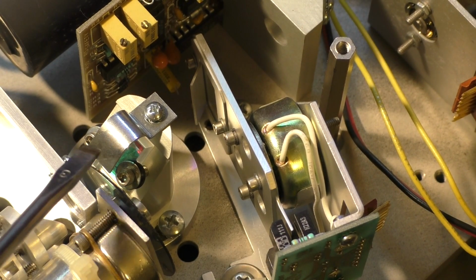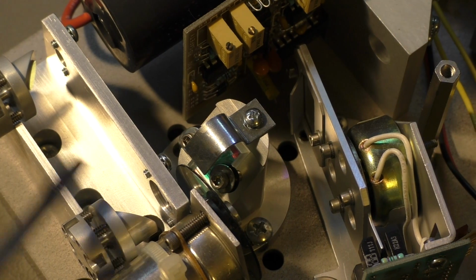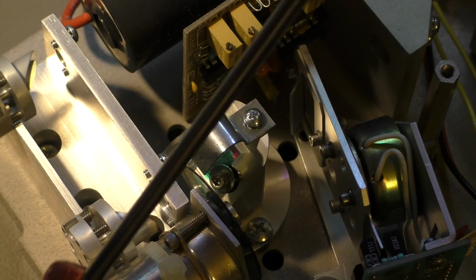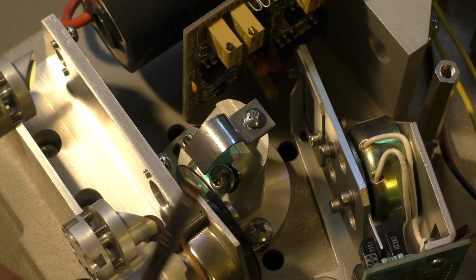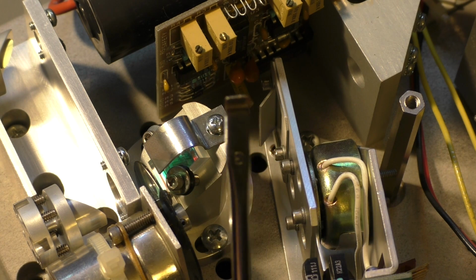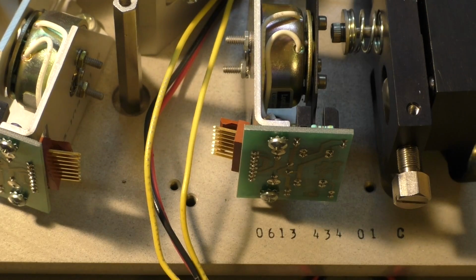Now there is another feature here. This is, let me move the camera a bit. This is the second mirror. This is the first mirror from the laser tube. Laser beam goes that way. And here is a mirror in a 45-degree angle like this. It lets the red beam go through this way, and the green beam comes from underneath on that side here. This is where the big laser tube was attached, and it reflects the green beam from below into that direction, into the same axis as the aiming beam goes, into the fiber, and then to wherever you need it.